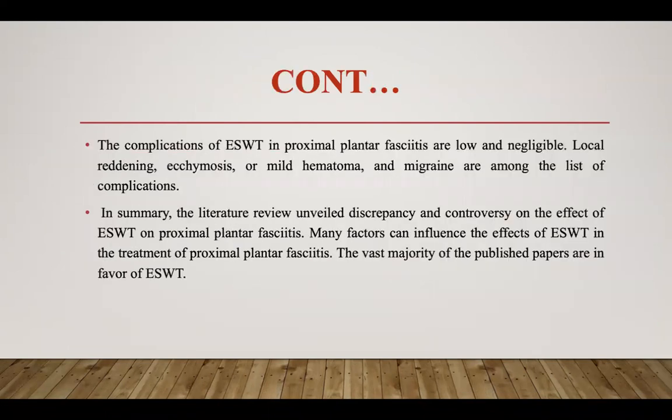Let's continue. The complications of extracorporeal shockwave in proximal plantar fasciitis are low and negligible. Local reddening, ecchymosis, mild hematoma, and migraine are among the list of complications.